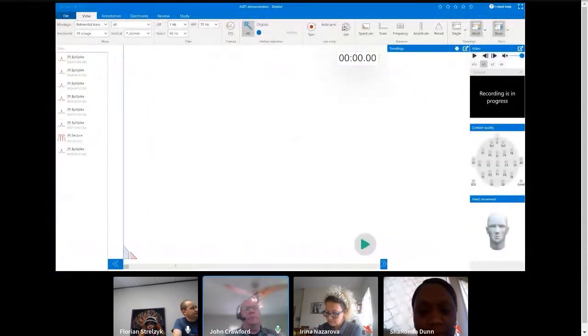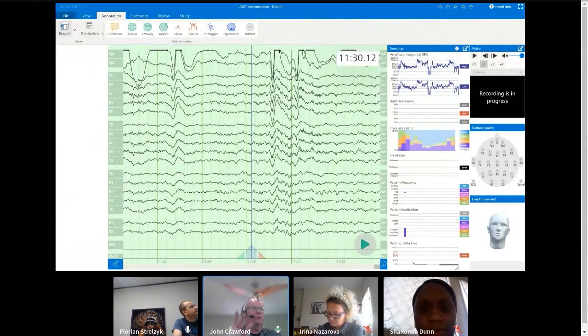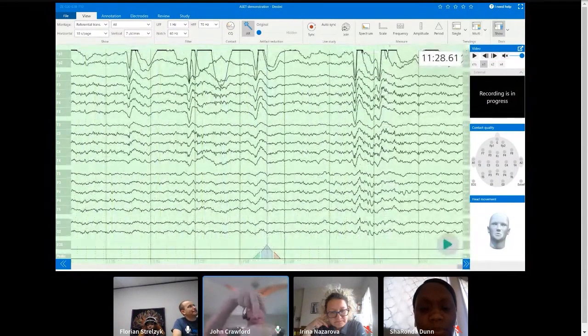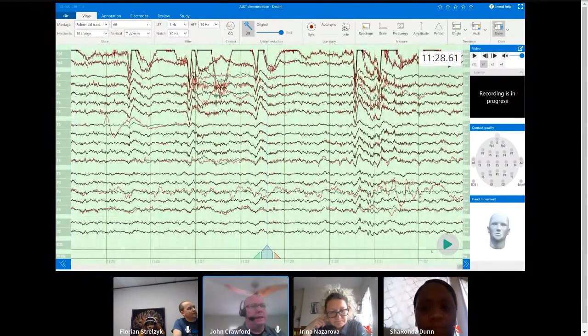With braids and everything, kind of like cornrows. There's an advantage sometimes to the Zeto electrode because it has this three prong aspect to it. So sometimes you can rotate those three prongs to straddle the braid, or actually put one leg straight through the braid, just as long as it's touching skin.